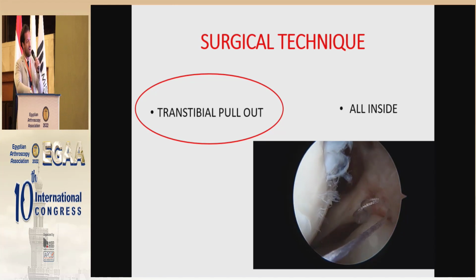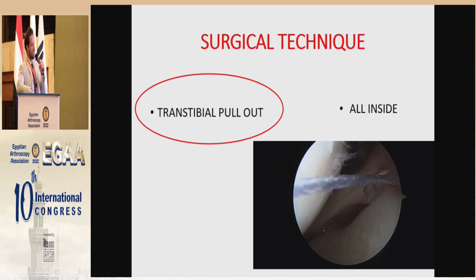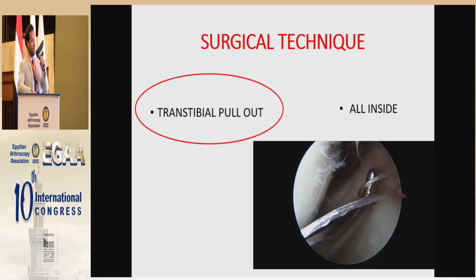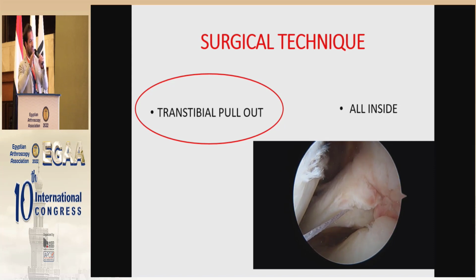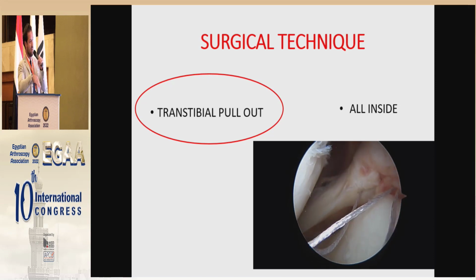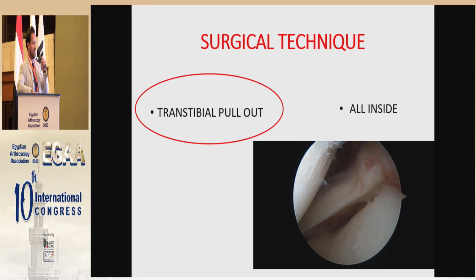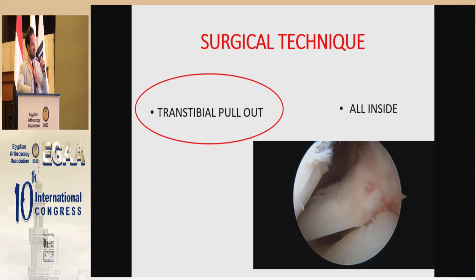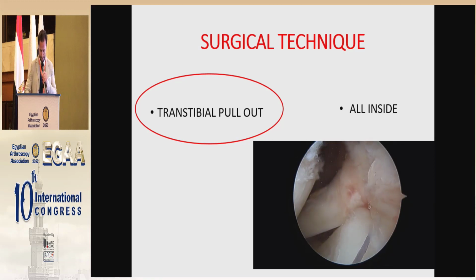I did the all-inside procedure, and this is a medial view from the medial portal. Be careful because I use this device from the lateral side, and so for the direction of the device, be careful of the vessels because you are in a bad direction, but you can see the tension that I can achieve with these devices, a good result, before I do the ACL reconstruction.